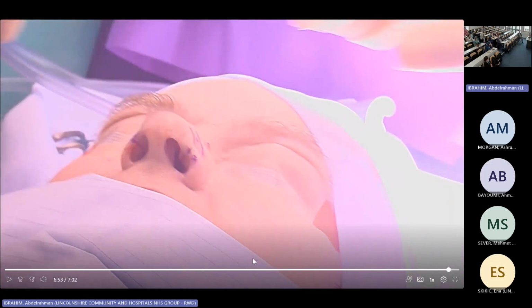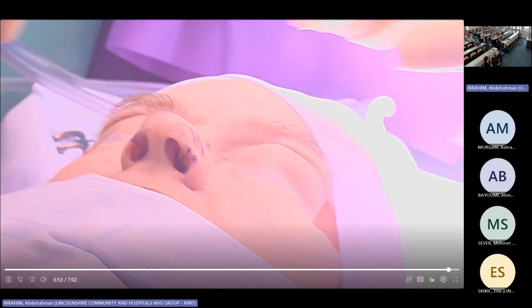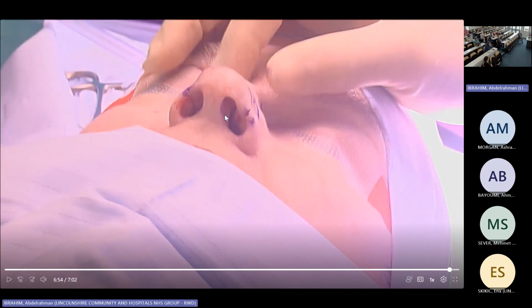And you can see the internal nasal valve from what it was, almost touching the septum. This is without any force, anything there, and it's very, very nice and supported. Despite she has a very collapsing nose, almost when she breathes in, everything goes in, and now we can see it's away from the septum, and her septum was almost clear there.